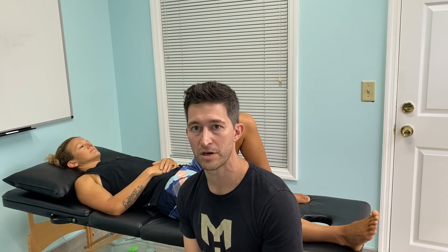The e-stim has been shown to basically reset the neuromuscular system. If we can get the e-stim connected to the needles, instead of sending a signal up to the brain that says pain, pain, pain, it's going to counteract that signal and you'll be feeling vibration instead — and it's going to block the pain signal. It's not going to fix anything per se, but it will reduce the patient's pain during needling and afterward, as a way to reset everything and get back to movement patterns that might have been painful before.